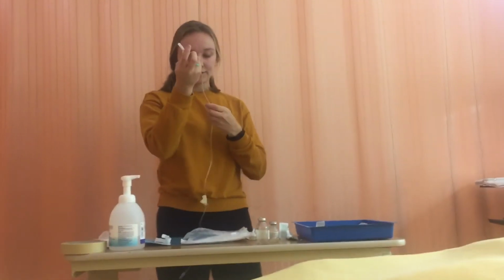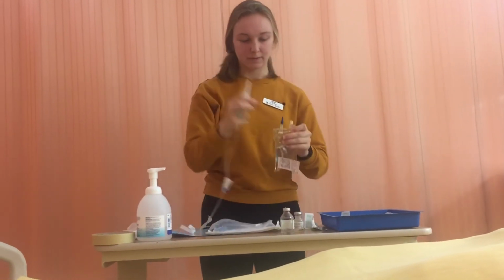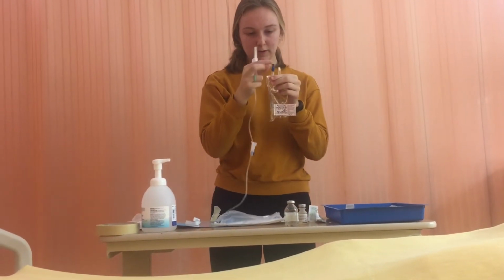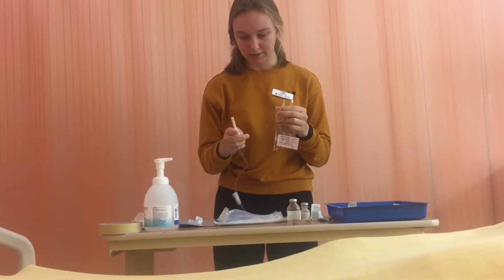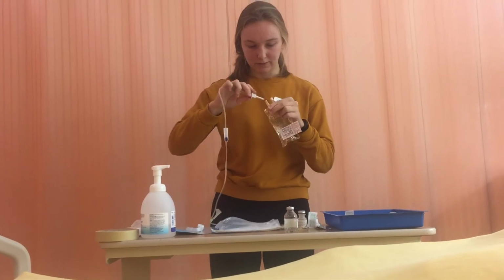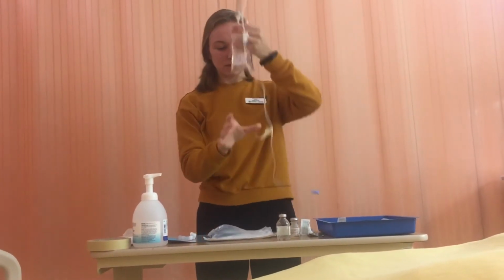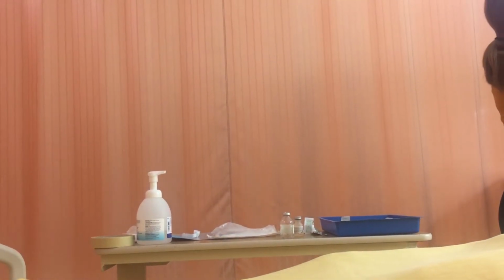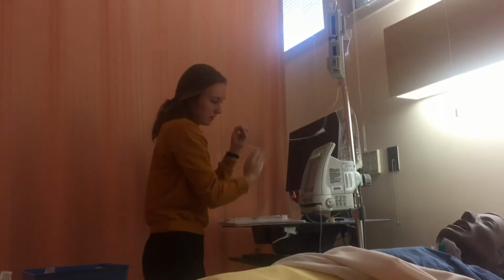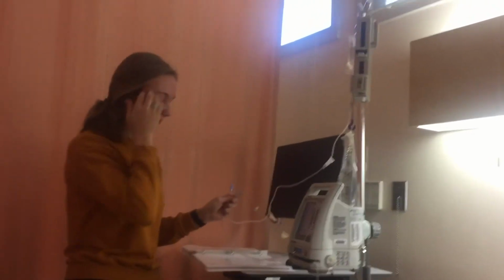So now I'm going to close the roller clamp so we don't lose any medication, and I'm going to remove the cap and sterilely remove this cap, and now I'm going to spike the mini bag, and I'm going to hang up the mini bag here, and I'm going to attach it to the port above the Baxter pump because we want it running through the Baxter pump. We want the secondary line to be regulated by it.